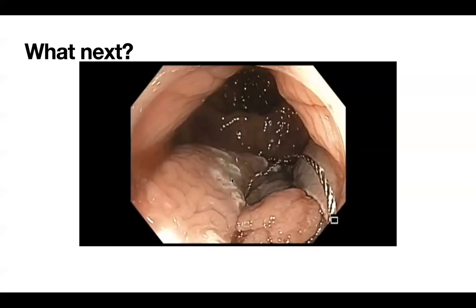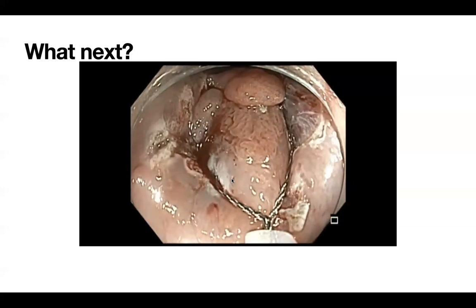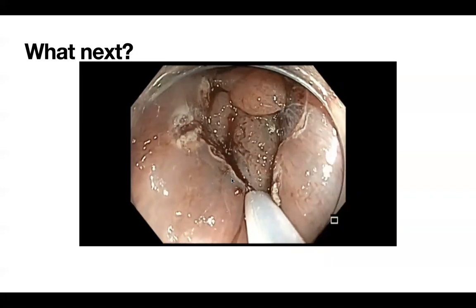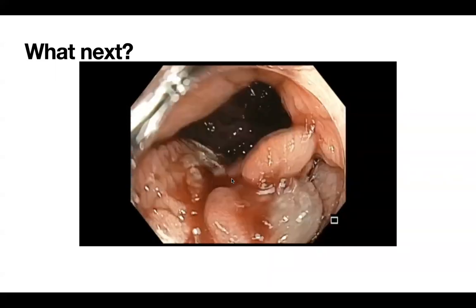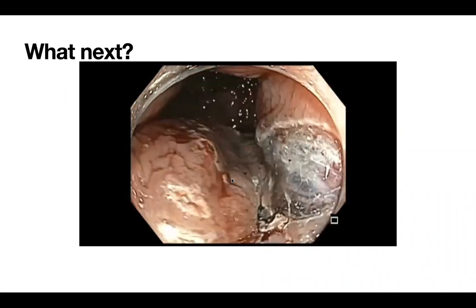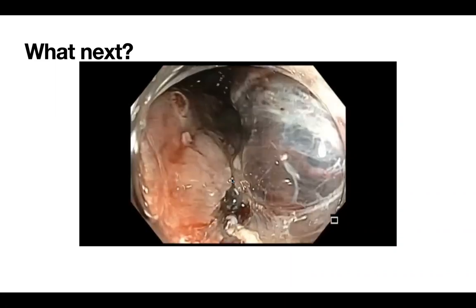The other thing is, before I started the cut, I decided to check the location of the lesion, and this lesion was not in a dependent position. That is something important to keep in mind, because when you cut over hemorrhoids and the hemorrhoids were to bleed, you would not find your source of bleeding if the lesion was in a dependent position.